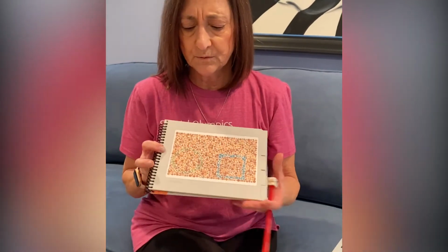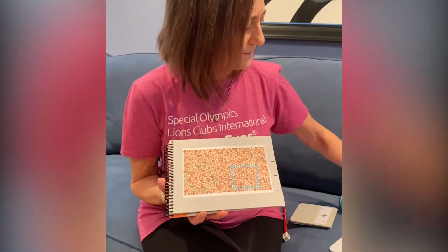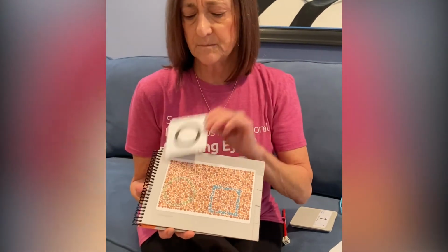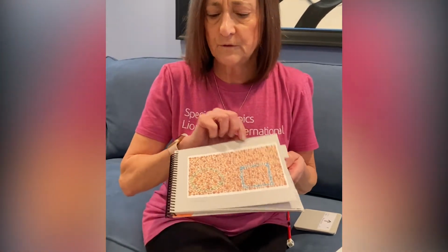There are 9 test plates, and we're going to ask them the same question. It's very simple. Find the circle. Now, sometimes if the athlete needs to be able to match something, I'll use the circle from the Lea symbols and say, see this? Find the same, and ask them to put this on top of the card so that they can show where the circle is. That's just another way of doing things when the athlete doesn't have the ability to communicate verbally.